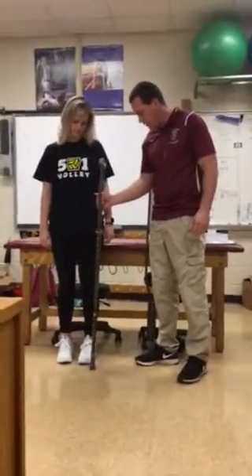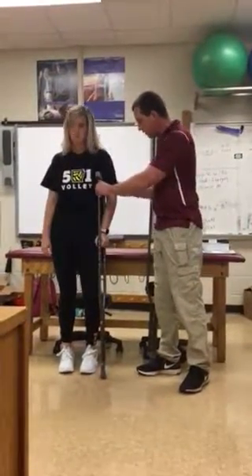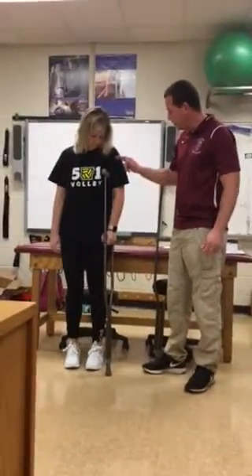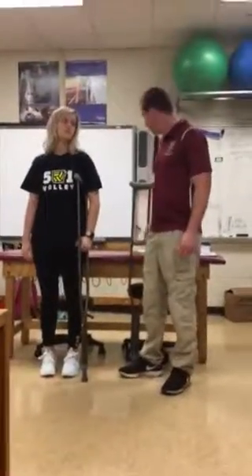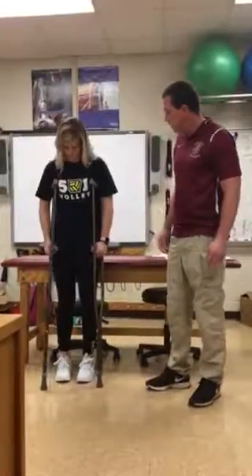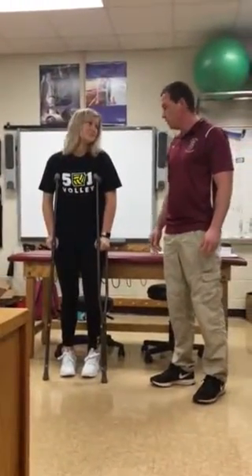Once we put that in the new location, it should fit her a little bit better. So again, I'm going to go about 3 inches forward and about 2 inches laterally, slide that under her arm, and she's got a better angle at her elbow, which is where I want for her to actually use the crutches. I've already fitted for this one, so this one should be in the same position — and that looks like a good fit for her.